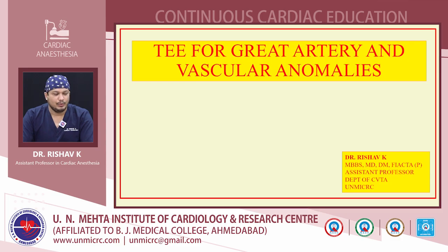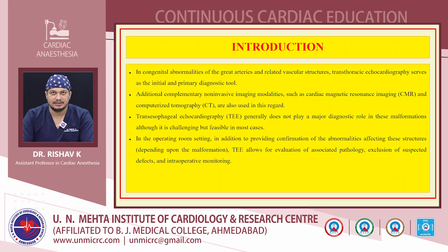So today I am going to discuss a topic which is a little bit of an outlier topic, that is transesophageal echocardiographic evaluation for great artery and vascular anomalies in pediatric patients presenting with congenital lesions. So starting with the introduction to this topic.